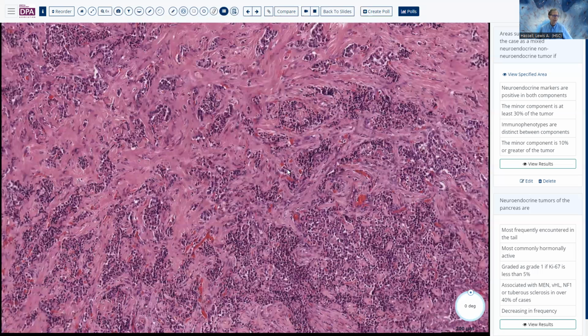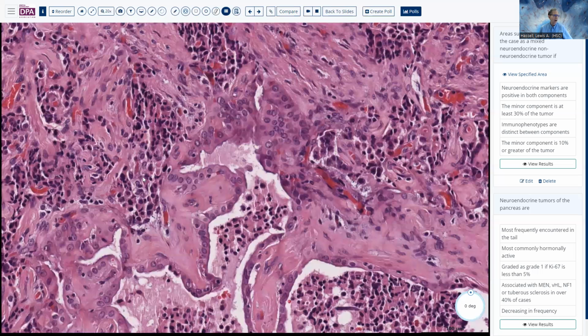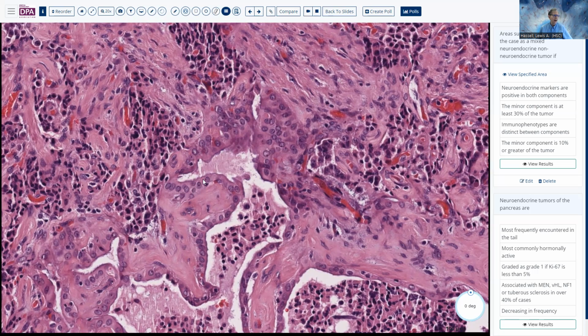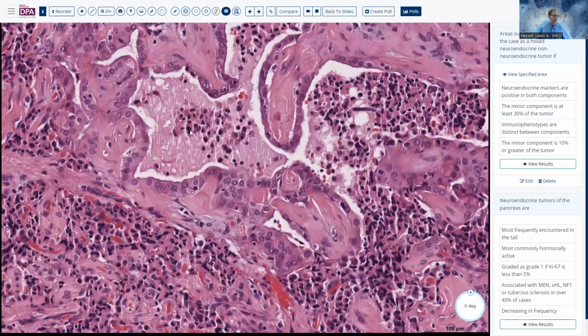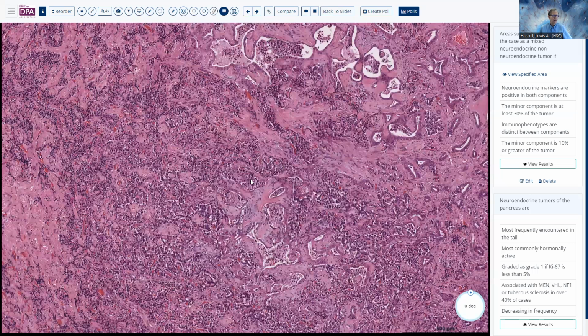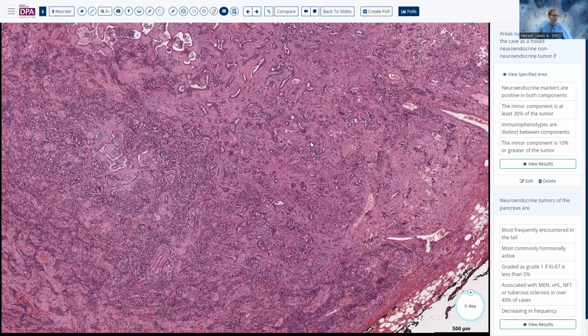And then down here, we see very clear-cut glandular differentiation, and the cells look cytologically distinct from these more darkly staining neuroendocrine cells. In contrast, these cells have somewhat more open chromatin, small nucleoli, a brush border type of appearance along some areas here, but they seem to be intimately associated with some of these probable neuroendocrine cells. So is this a part of the tumor? Is this entrapped glands that have come as the tumor has engulfed pancreatic parenchyma and retained the ductal component?